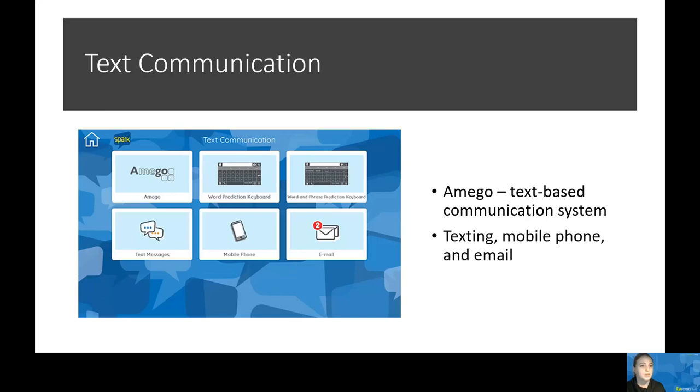We also have a word prediction keyboard and a word and phrase prediction keyboard. This is for users who aim to create novel messages with the additional support of predictive phrases and words. Within this grid set, there is also an app for text messaging, phone calls, and email. The text message app allows a user to send a text message — if there are individuals added to the contact list, those individuals show up automatically. With mobile phone, you can answer and make phone calls. With the email app, you can add contacts to your contact list, type a message, and then send and receive emails.